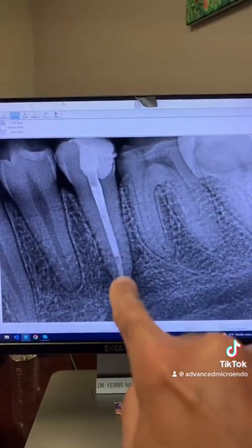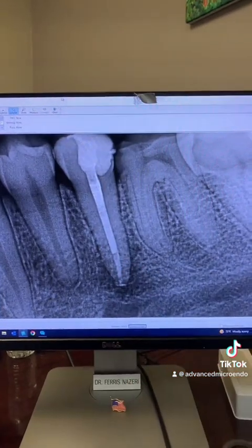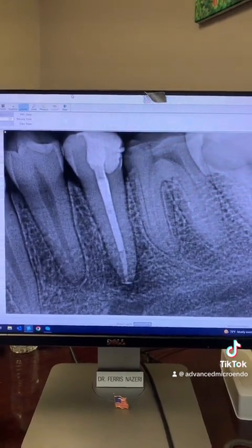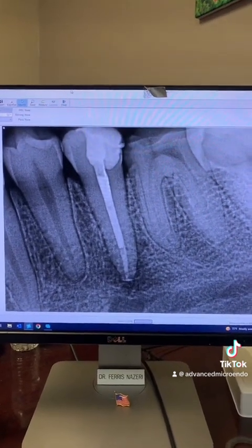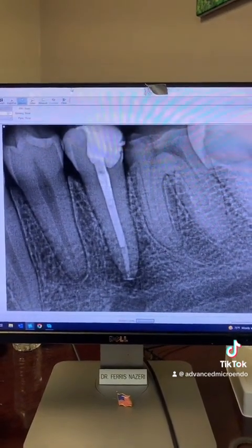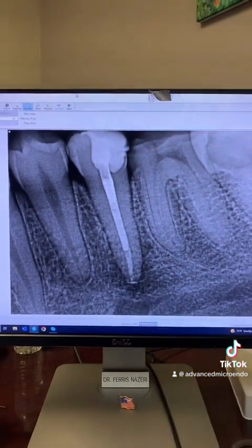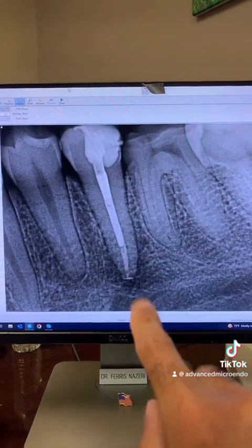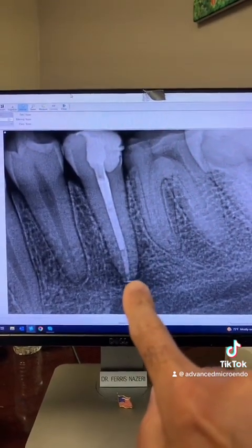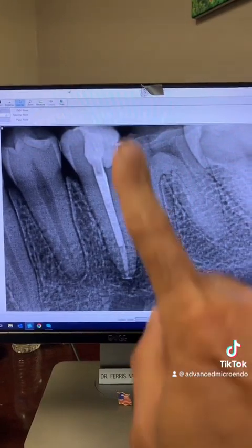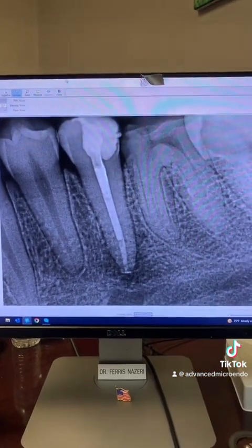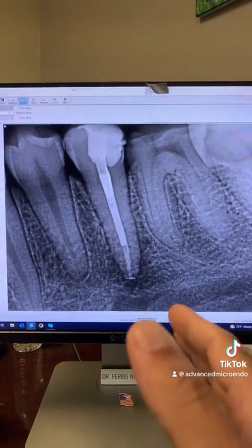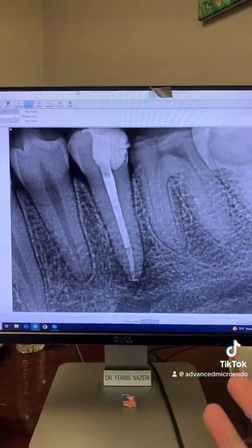I completed this in one appointment. When I accessed the tooth endodontically, there was purulent discharge. I irrigated with 6% sodium hypochlorite, activated the sodium hypochlorite, performed my instrumentation and shaping, and at the end used microsuction and paper points — the canal was dry and the discharge had stopped.